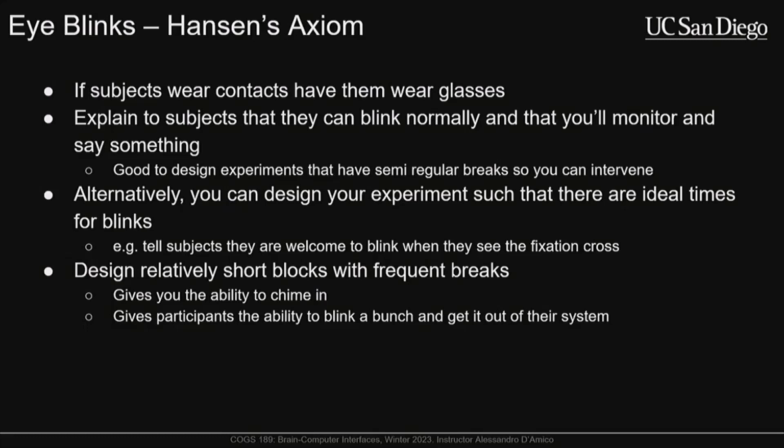So we're thinking about them completing an experiment like a P300 speller or an N400 language task. You really want the user to be focused on the task at hand, whatever you've given them, and you don't want them to be thinking about not blinking or blinking at specific times. So you want to give participants this feedback only when you need to.